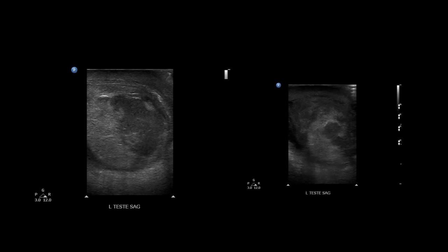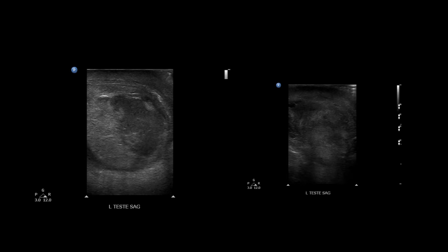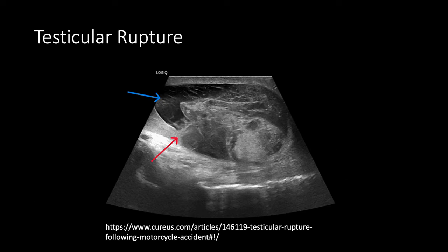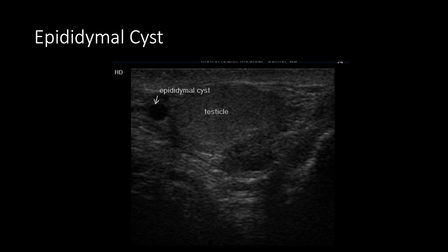An example of testicular rupture shows the tunica albuginea completely elevated from the scrotal sac with a large organizing hematoma developing septations, and the testicle and epididymis compressed into the inferior portion of the scrotum. Surgical salvage of at least part of the testicle is usually attempted. Moving on to other findings.